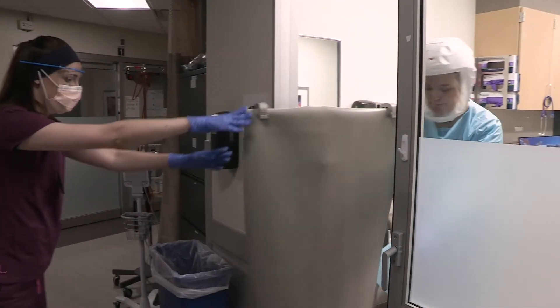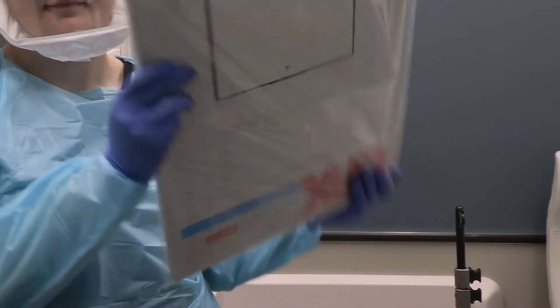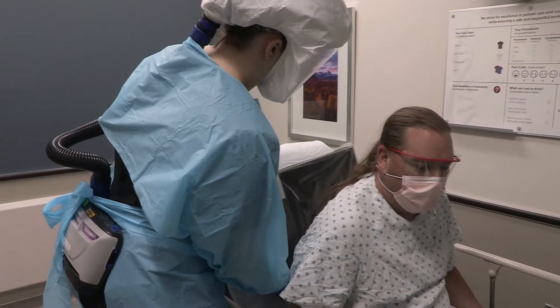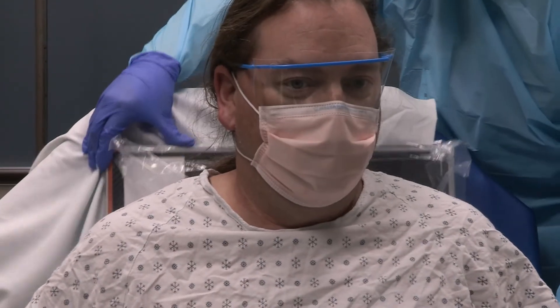The technologist will pass a lead shield and the detector with a single bag covering to the nurse through the open doorway. The detector will be placed in landscape orientation with the black side against the patient's back and the top edge of the cassette extending one inch above the patient's shoulders. The patient's back should be flat against the cassette.